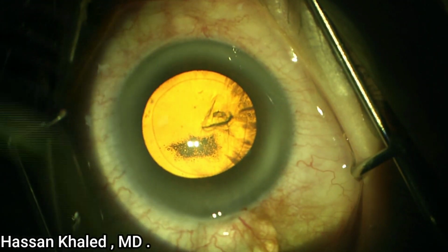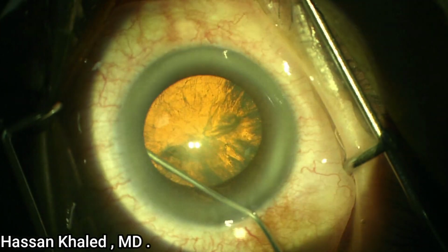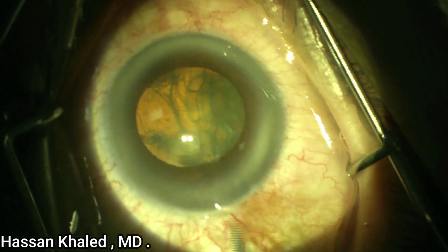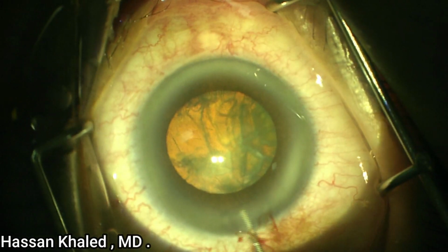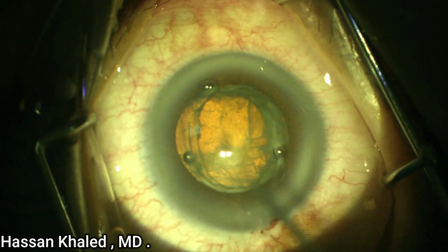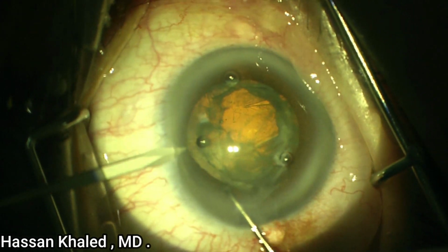Another important step before doing hydrodissection, you can empty the anterior chamber slightly from the viscoelastic. Now you can see the hydrodissection, a beautiful posterior wave, then gentle hydrodelineation as it's clear. I always prefer to inject a small amount of viscoelastic to lift the cortex and to see the nuclear cataract, to see the nucleus.